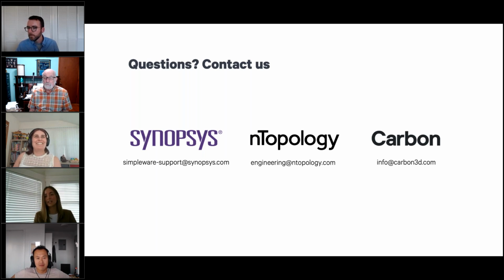Sorry, Alison. Yes, and so I just wanted to comment, in the video, it might have been confusing. I was actually duplicating. That was not mirroring. So there were two of the same part on the platform. That's just showing printing two of the same part at the same time. If you were doing a left and right cutting guide, you would upload each unique part and you could print them both at the same time. I would just add that the practicality of printing two is it's virtually no more cost in the print time. And the reality of operating theaters is sometimes things drop. So having a pair of guides handy just makes time in the OR smaller.